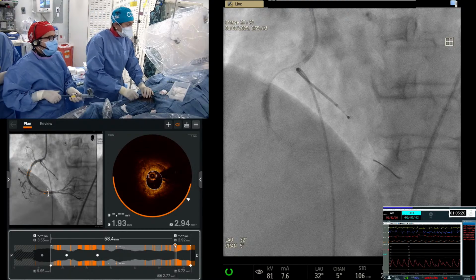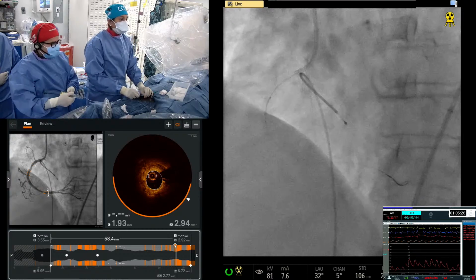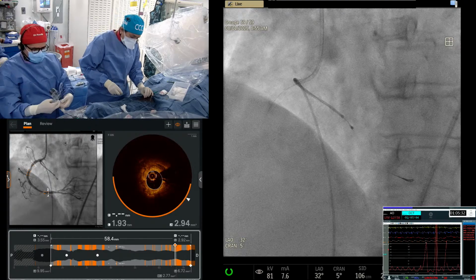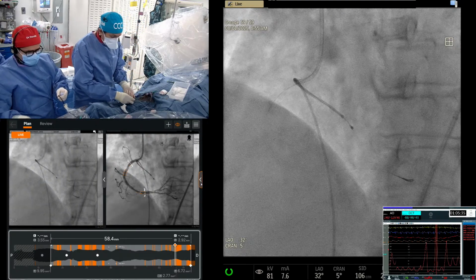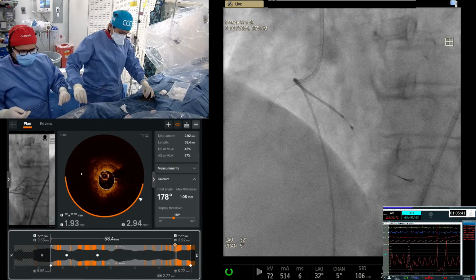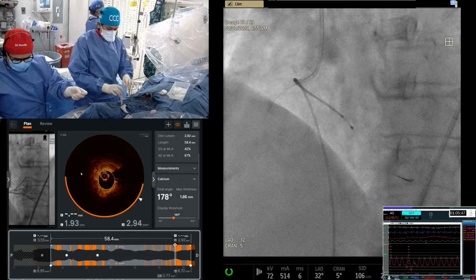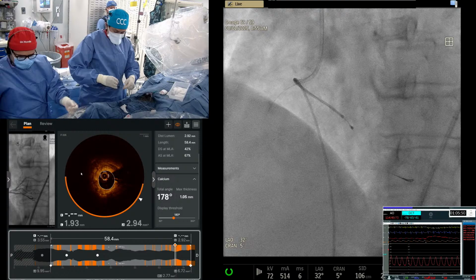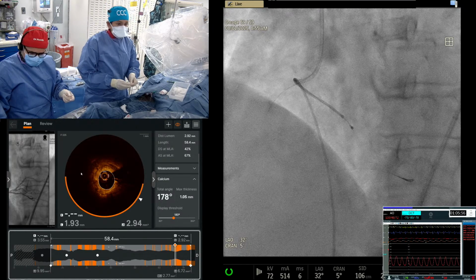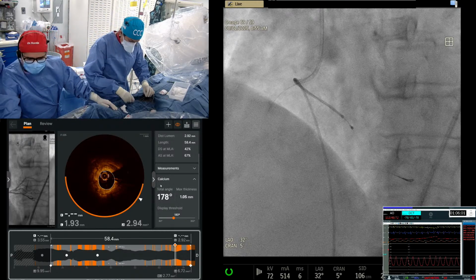So we are now still 10 left. I think we are looking good. We are coming out. Right? Okay. Yep. Amit agrees. So now instead of doing an angio, can we save dye and do a quick OCT? You probably get 2 for 1 there. Yes. I would still be interested to see how the RV branches, or that marginal branch rather. I mean, so far no EKG changes. Based on that, I think we should be okay.